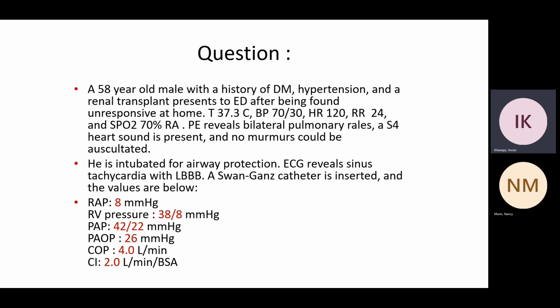Now, the numbers here, and I'm not sure about the source of the question, I have to remember where I had this question. Your wedge here is higher than the PA diastolic, right? I mean, that doesn't happen often. It might happen in a few situations where your wedge can exceed your PA diastolic. This won't be the typical. So, yeah, keep that in mind here.